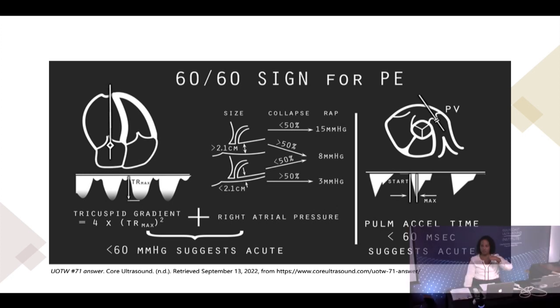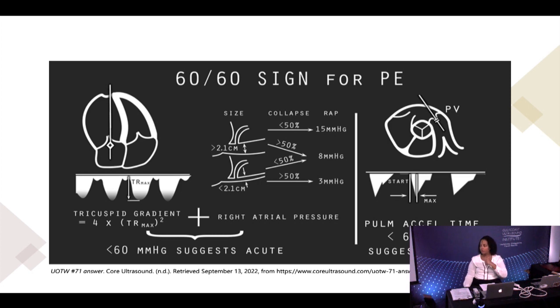And like I mentioned earlier, we can fan it either up or down to bring other structures into view. So if we fan towards the right shoulder, normally we're going to bring this Mercedes Benz sign right here, which is our aortic valve. And when we bring the Mercedes sign or the aortic valve into view, we're seeing the right atrium right here, adjacent to it, followed by the tricuspid valve, followed by the right ventricle, and finally by the pulmonary valve and the pulmonary artery.